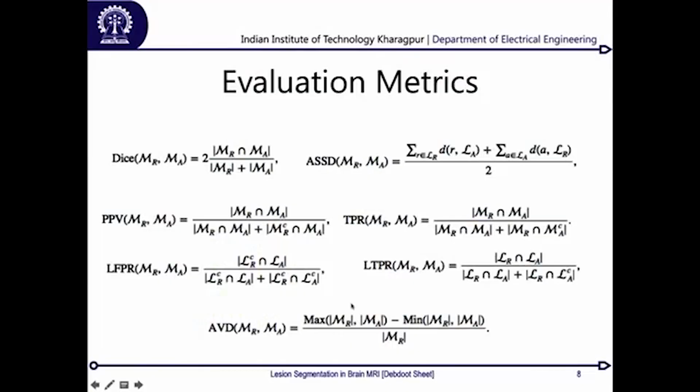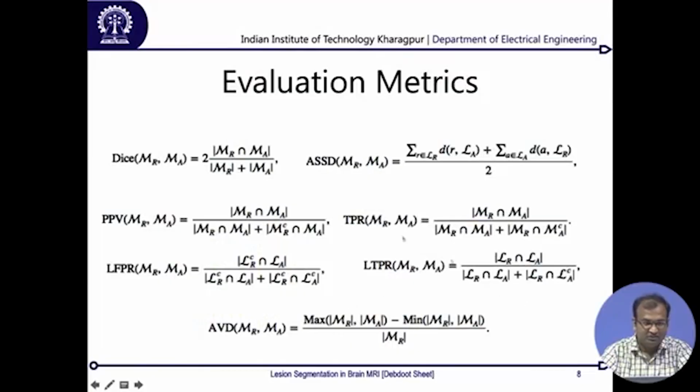Now from there we enter into evaluation metrics. What they use are some of the standard metrics which we had already done, except for one major thing, that this is extended onto the 3D space. Earlier, what we had done on the matrix were all in 2D space, when I was discussing it in systematic evaluation and validation.